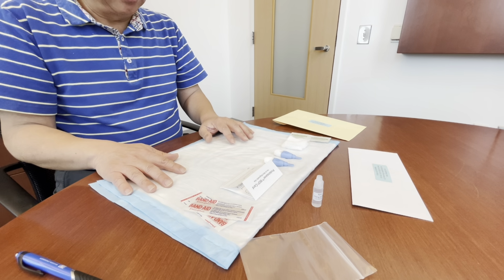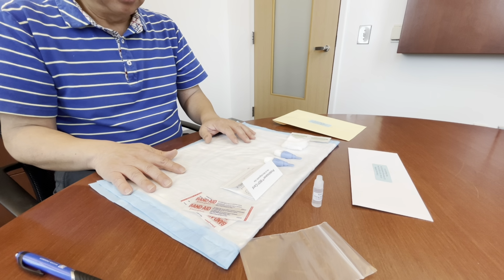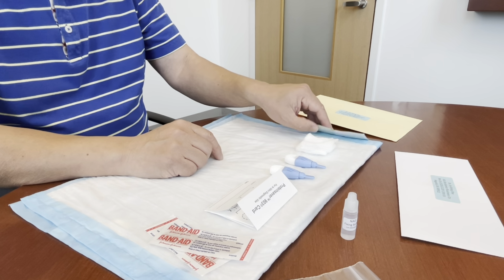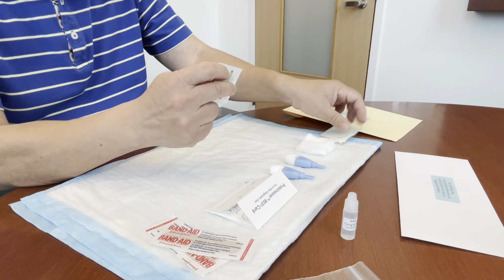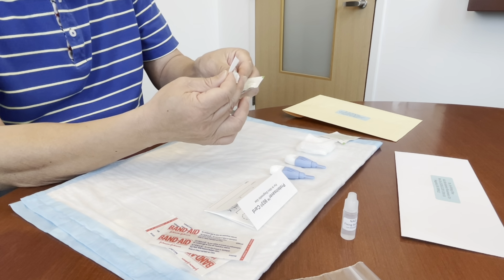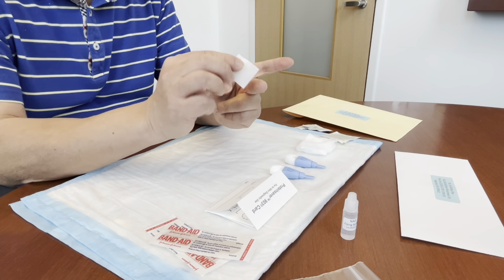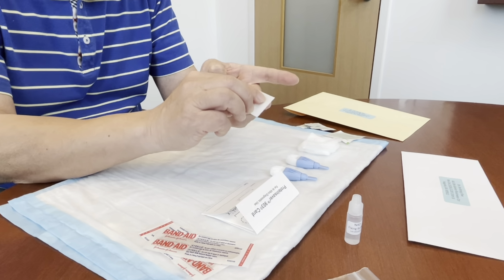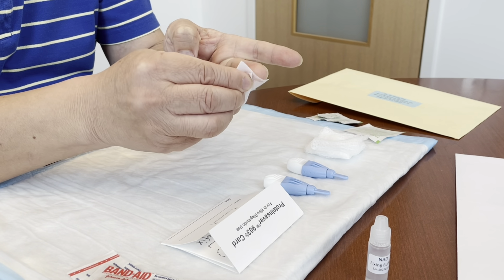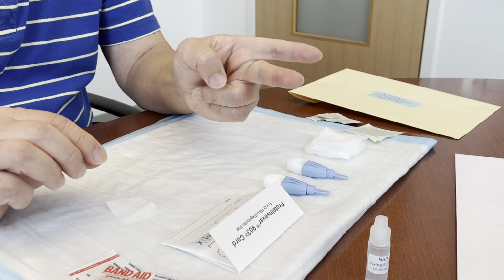When your kit is laid out, wash your hands well with warm water and soap. The warm water will improve blood circulation to your fingers. Dry your hands. Use the alcohol pad to clean a fingertip on your non-dominant hand. Middle and ring fingers usually work best. Let your finger air dry.